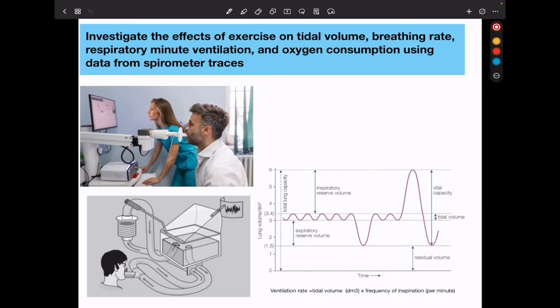After, you can switch the spirometer back to air position and instruct the subject to remove the mouthpiece from the mouth. You switch off the kymograph and return the spirometer to the chamber position and purge the chamber by lifting the floating pad up and allowing it to drop a few times. The spirometer is now ready to be refilled with oxygen.